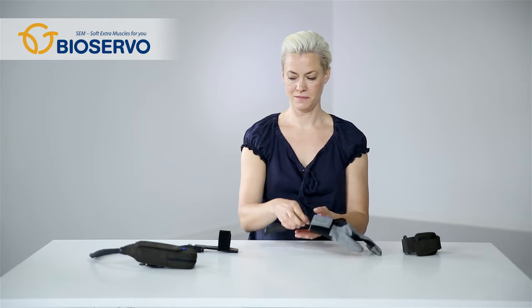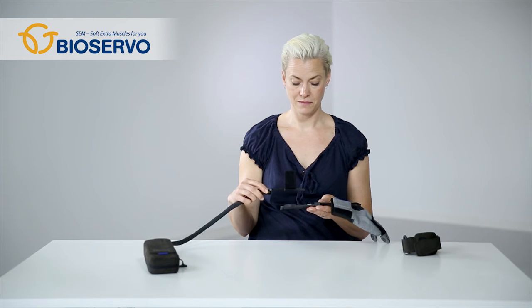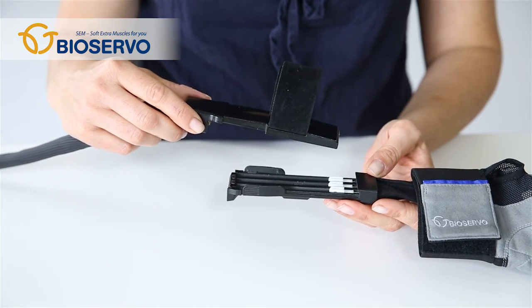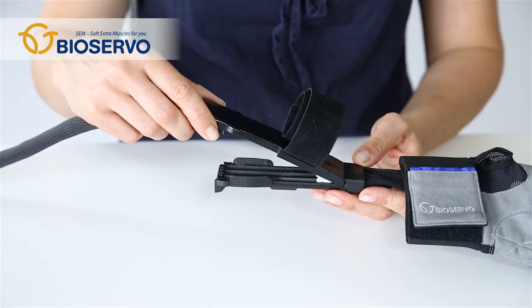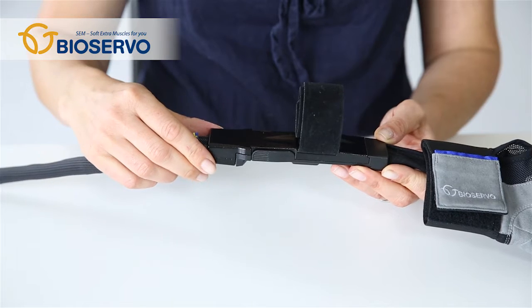Close to the glove there is a connection that can be opened, separating the glove from the SEM unit. This gives the possibility to switch between gloves or replace an old glove. Connect the glove with the unit by mating the connecting parts at the joint. The closing is confirmed by a snap.